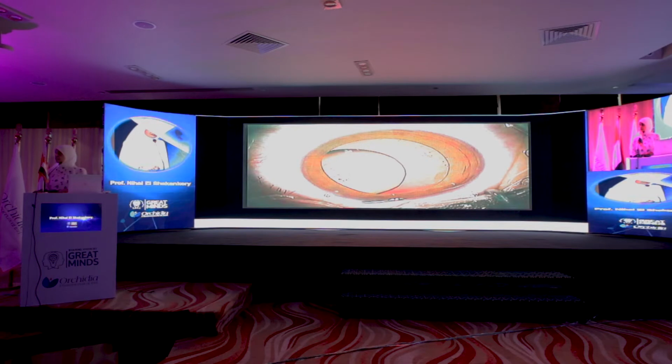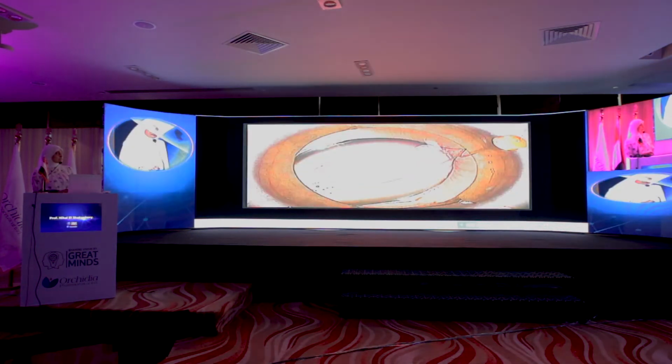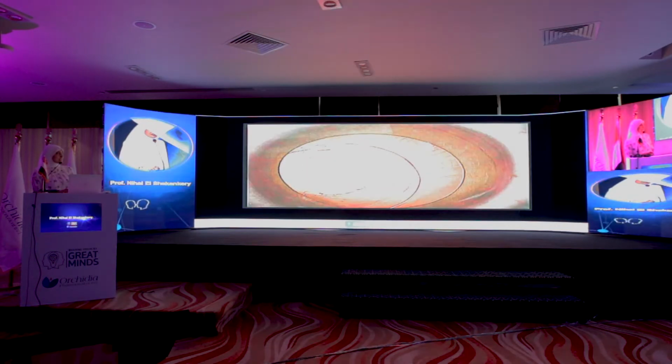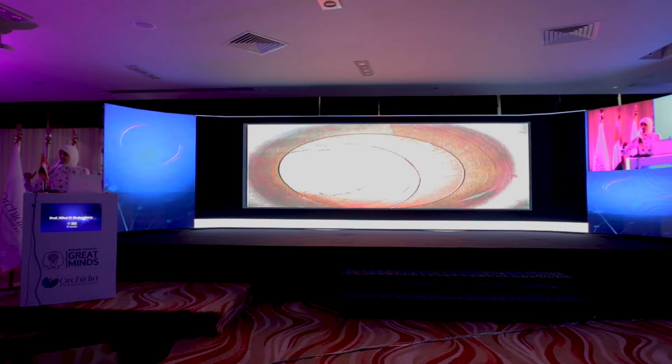Another advantage of this iris hook is that, can you see here, before irrigation aspiration, the zonules are there. When you go for hooking of the capsule, and then you go for irrigation aspiration, after irrigation aspiration, the zonules are still there, indicating that there is no prolapse during irrigation aspiration of the anterior vitreous space, indicating that you don't disrupt the anterior vitreous space.